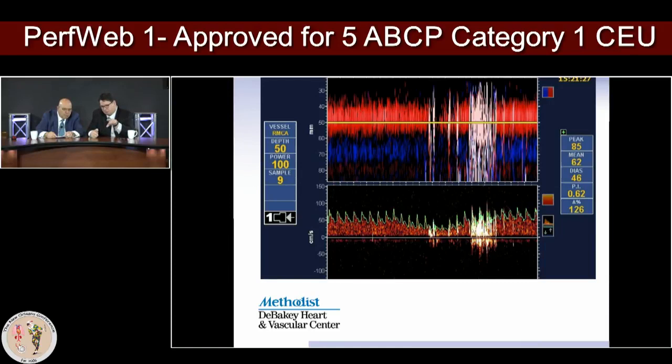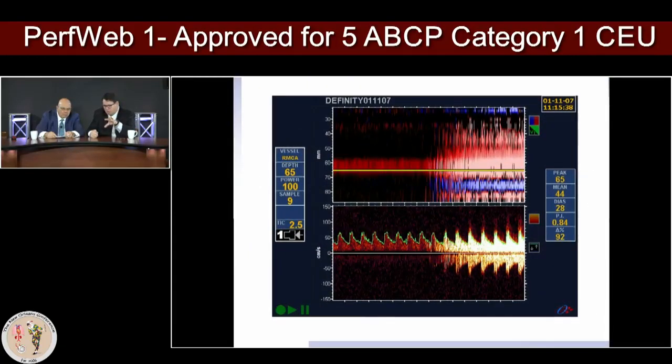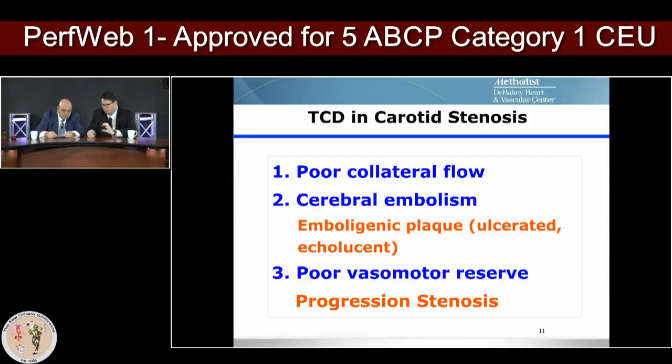So that is the main maneuver you can really control and see how the TCD blood flow changes. That's actually done during the PFO test. And this is how the TCD signal can improve with a contrast material, a contrast agent injected in the circulation. So TCD definitely sees the entire hemisphere, not just a focused part.